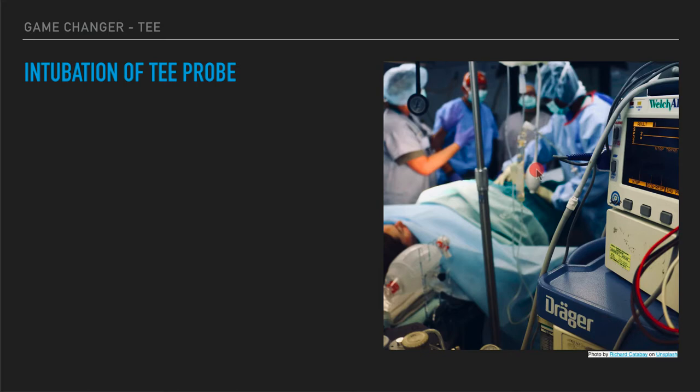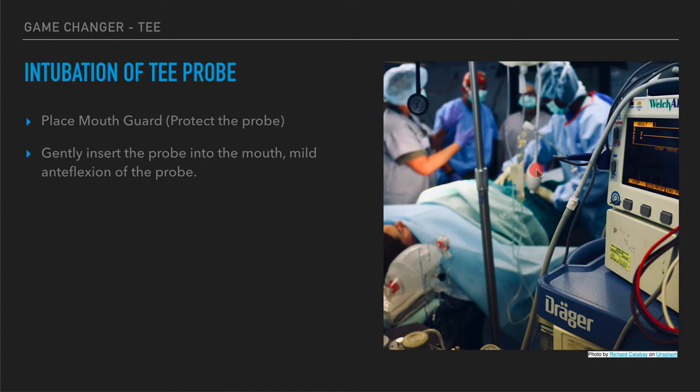Let's talk about intubation of the TEE probe — this is really where you're going to need to do the most learning. You already have skills to interpret the images, and as an expert in airway with many tracheal intubations, but this is an esophageal intubation with a big ultrasound probe, so we need to make sure you know how to do it safely. First, place the mouth guard over the ET tube since we're always doing this on intubated patients, with a central hole for the transesophageal probe. Then gently insert the probe with mild antiflexion into the posterior oropharynx and advance down through the esophagus.